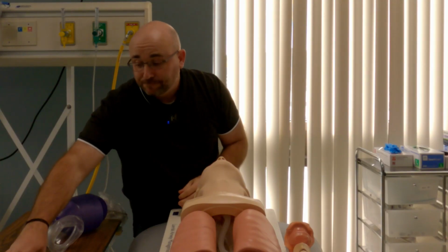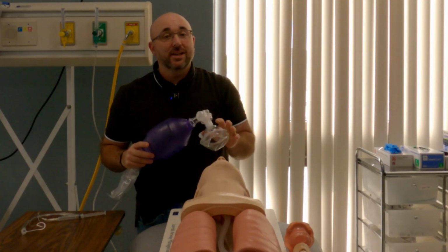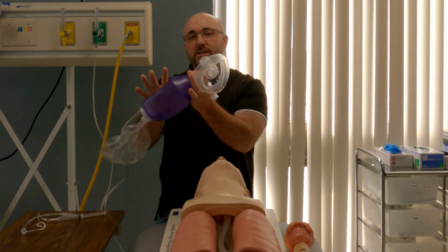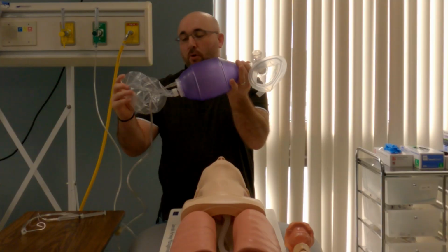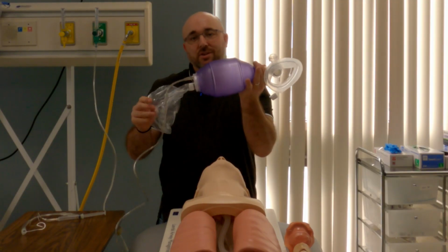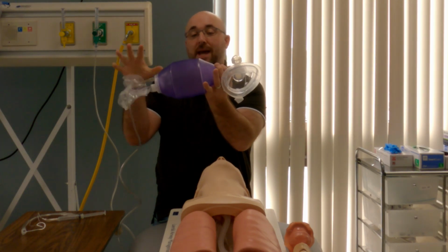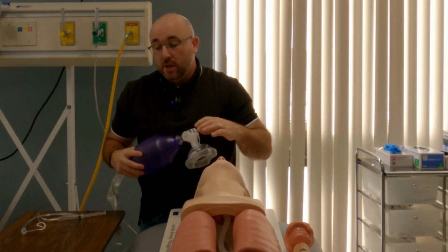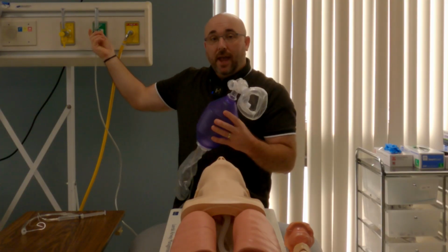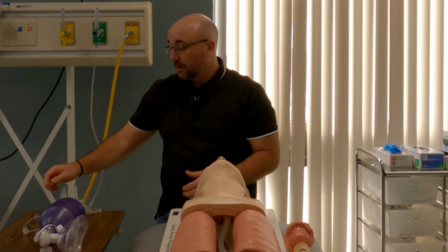Okay, so second thing, when you're assisting off to the right-hand side, you're probably going to be assisting with bag valve mask ventilation. And we've talked about this before. Bag valve masks, obviously, it's a self-inflating bag. If I squeeze it, it self-inflates, pulls whatever oxygen's running from here. In this case, I don't have anything running in, but you'll have at least 15 liters of oxygen running in here. This bag will be inflated. It delivers the breath, pulls the 100% oxygen from this bag back into here, so the next breath goes to the patient. So having this set up, having the mask on is really key, having the flow meter turned on, and having everything running off to the person intubating off to their right-hand side. So that's another piece to it.